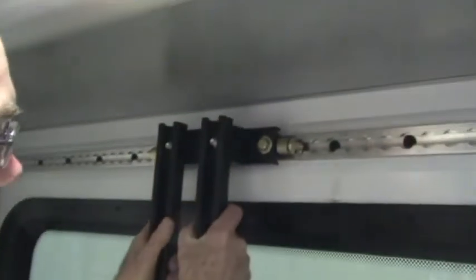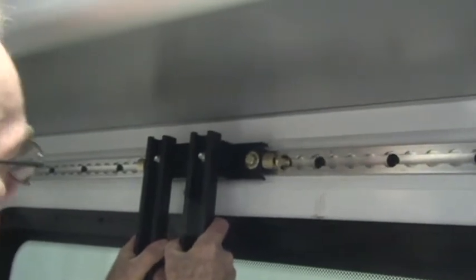We'll move up to the top and eyeballing it, we look to be fairly vertical there. It's a matter of pushing in and sliding one way or the other.